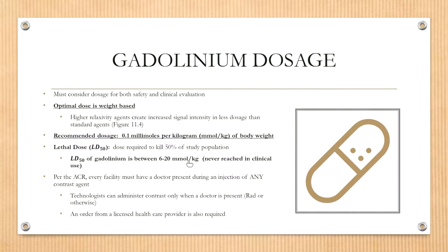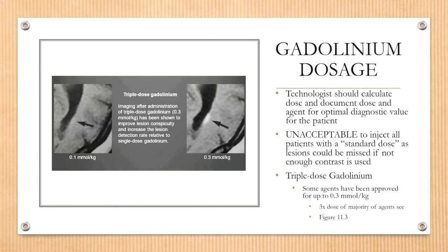Now, per the ACR, and especially if your facility is ACR accredited, you must have a doctor present during any injection. Now, it doesn't have to be a radiologist. It can be a regular doctor, but there needs to be a doctor present during the injection. And there needs to be an order from the referring physician indicating that contrast needs to be administered. You cannot just decide to administer the contrast yourself.